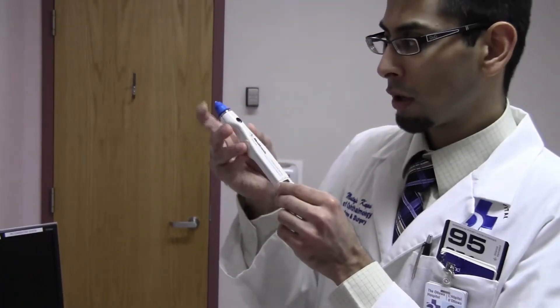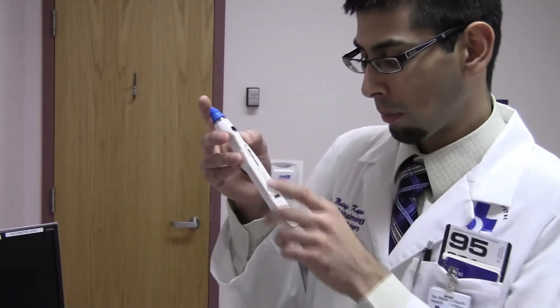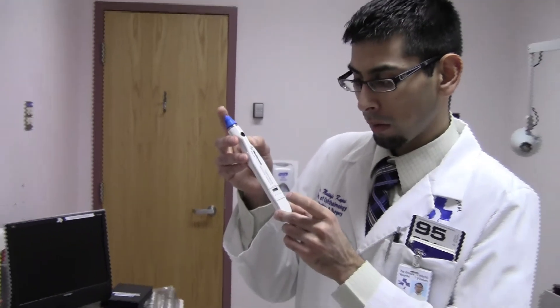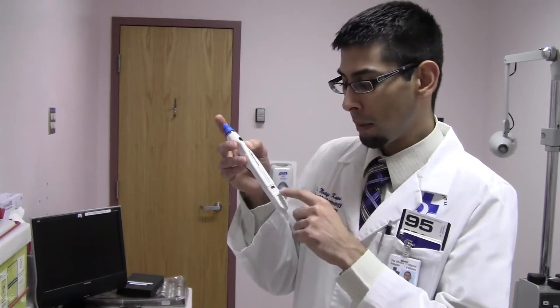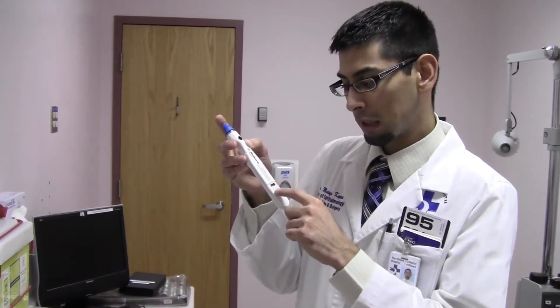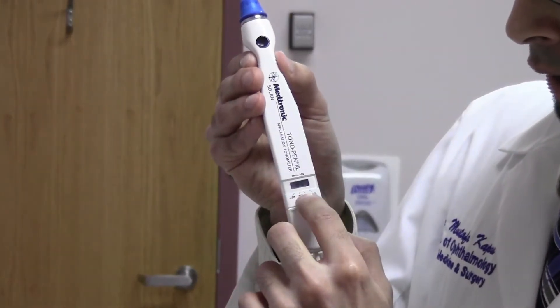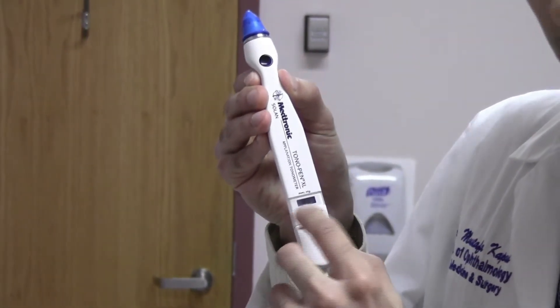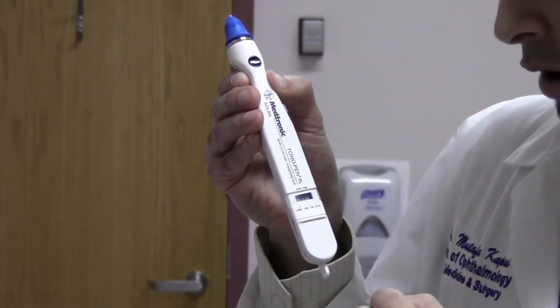The pressure is measured by gently tapping the cornea a few times. It'll make a few light taps followed by a long beep. Let's do that one more time. So there were a few light taps followed by a long beep. The pressure will be read on the LCD display here. There are a few numbers: greater than 20, 20, 10, and 5%. This is the standard error, and a little bar lights up right above the standard error.